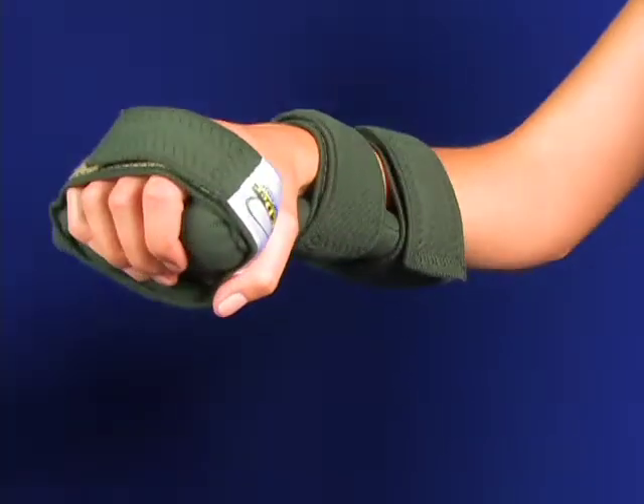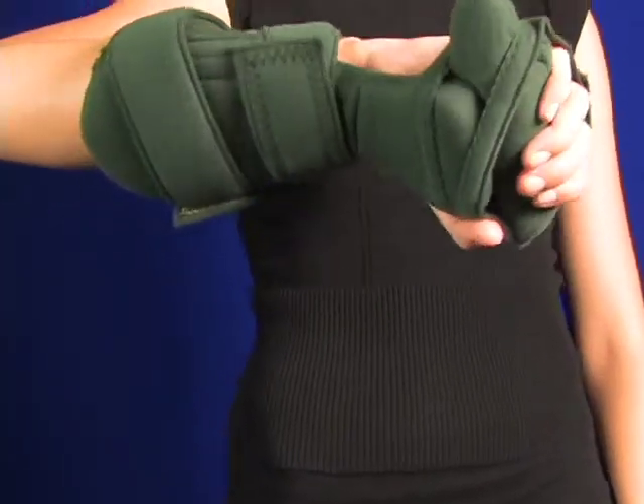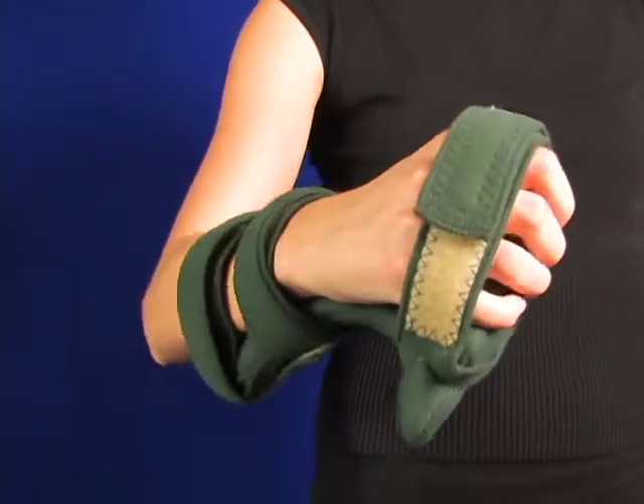There you have a good C position. That air carrot is inflatable — you can start off real small and then crank it up. It can be used all by itself, just the carrot.